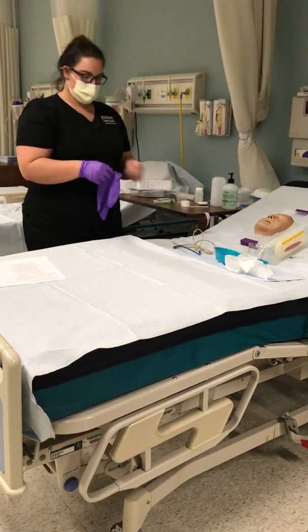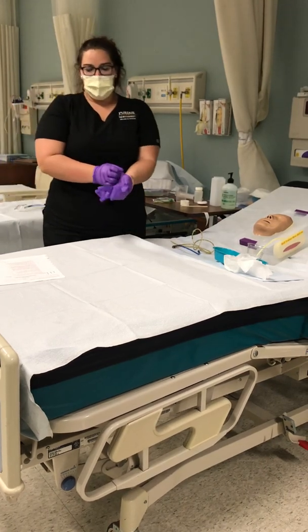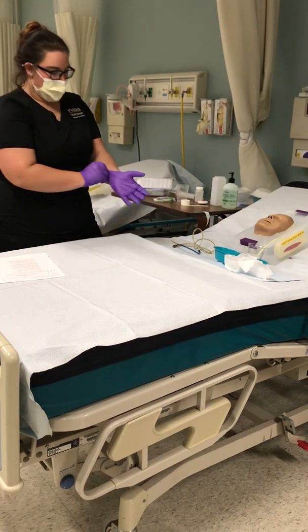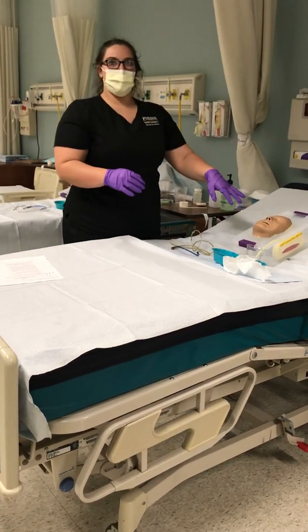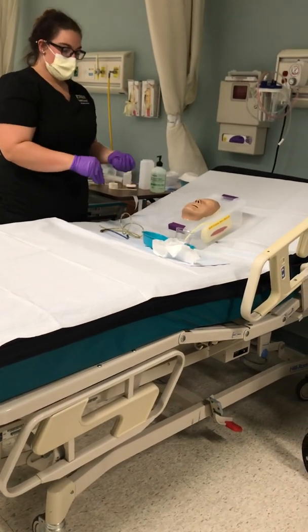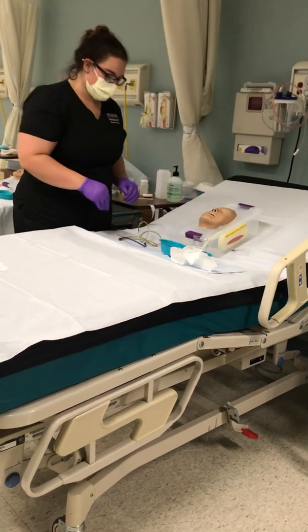I already have a piece of tape ripped and ready for after the insertion. I would ask the patient to occlude a nostril, and whichever one they can breathe better out of is the one that I would insert the tube into. So for our case, it's going to be this side.